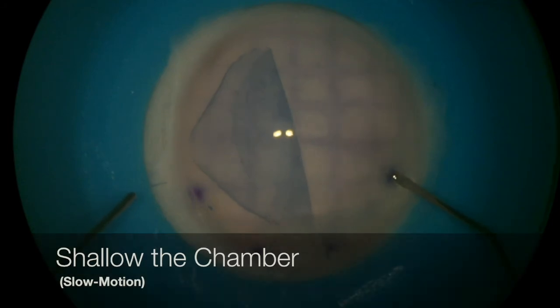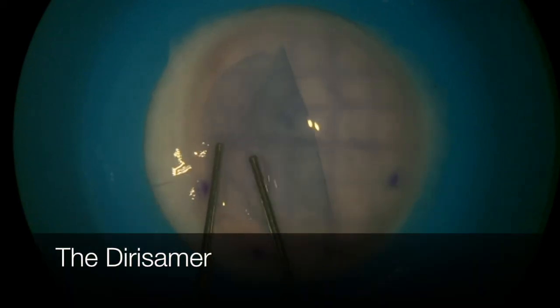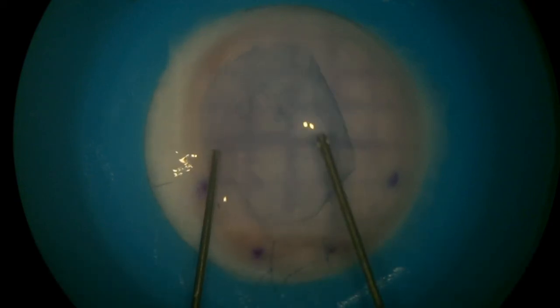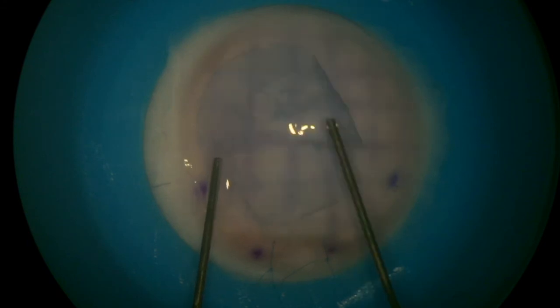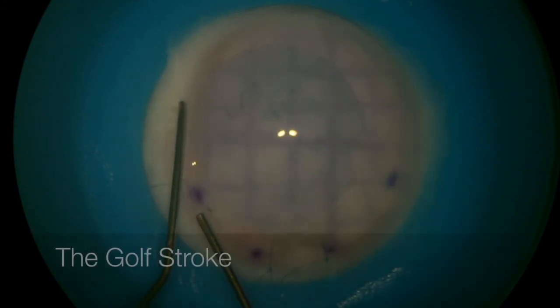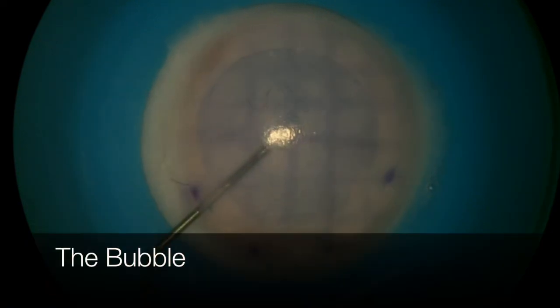You can then shallow the chamber and do the flick. And of course you can do the Dirisamer. And the golf stroke. And the bubble.